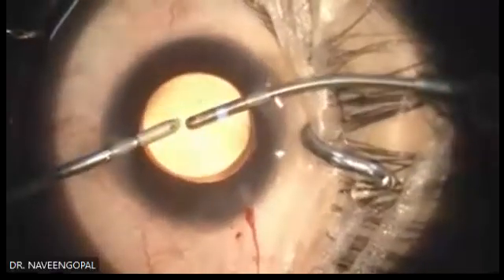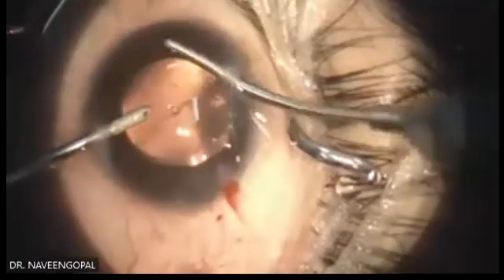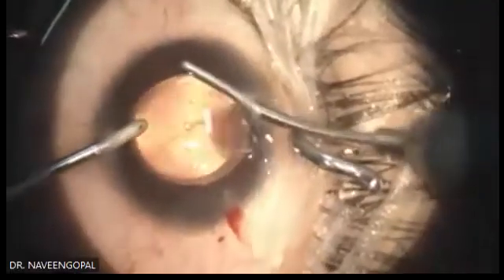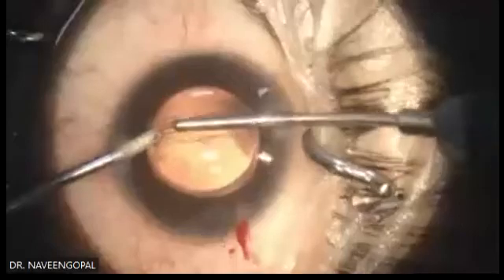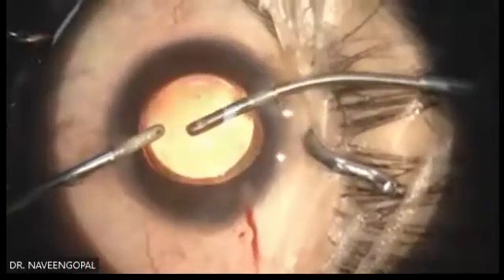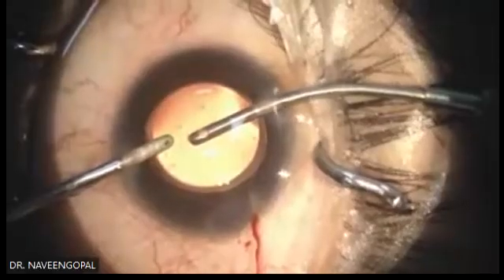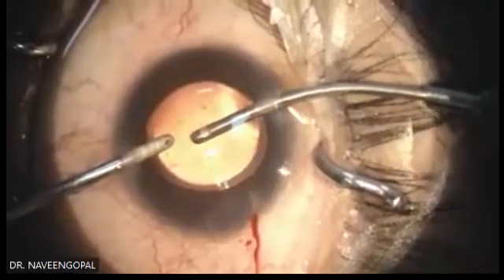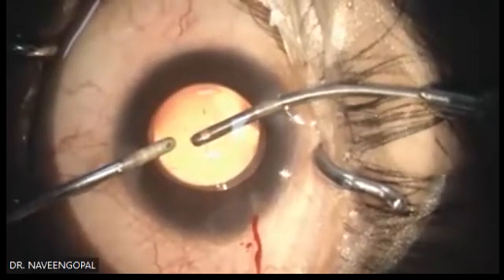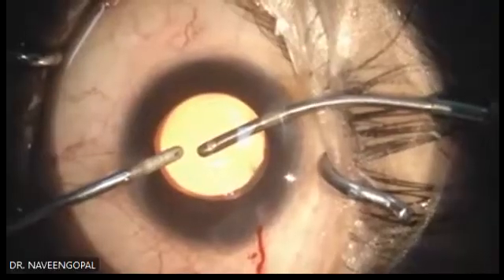Make sure that you remove viscoelastic even from the angles. Don't touch the endothelium. Don't touch the center part of the lens. Just place it in the center part of the lens and let your IA do the rest. Do this for 5 minutes. Be patient. It will take some time. Don't worry about it. My parameters are 350 vacuum. Aspiration is around 30, I think.